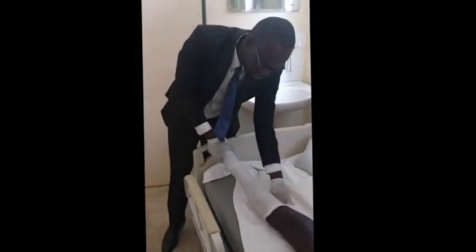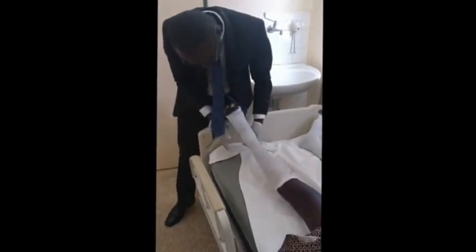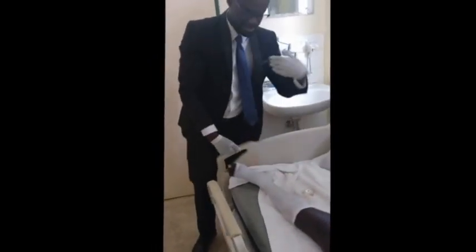So this is the second important thing that I'm doing. You need to smoothen out any wrinkles. Make sure it's smooth enough. I have my heel in the heel pockets, and I'm smoothing out any wrinkles. The smooth part of the stockings is close to the skin, and the rough part is outside.